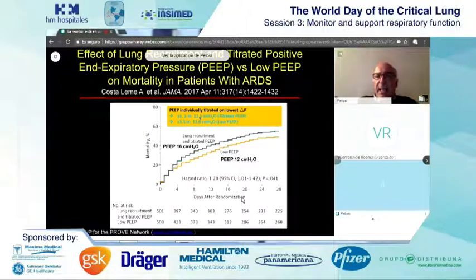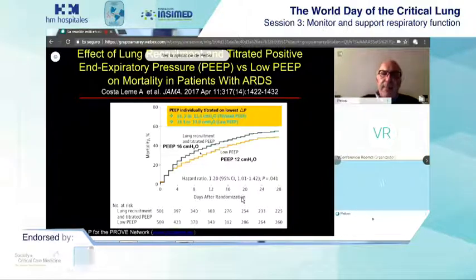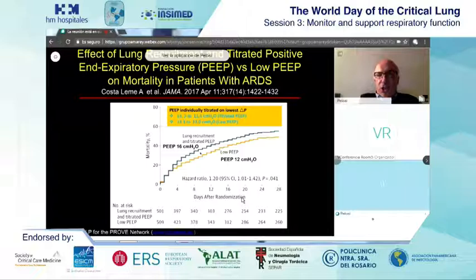This slide indicated that this group of patients was not natural. And anyway, this study showed higher mortality in the group in which PEEP was set according to the driving pressure. So again, similar to the study in anesthesia and surgery that I showed you before, driving pressure seems to be more effective to set the optimal tidal volume and not to set the optimal PEEP.